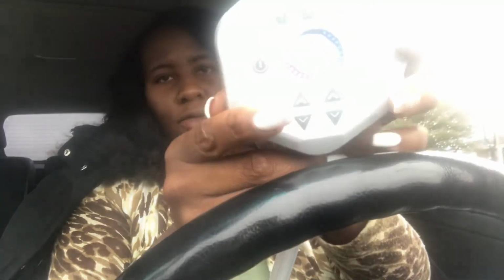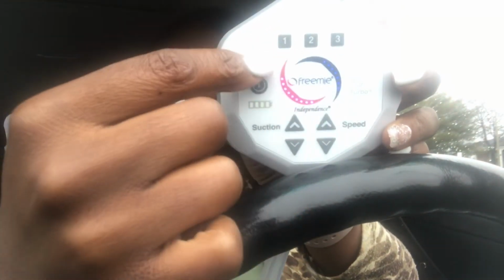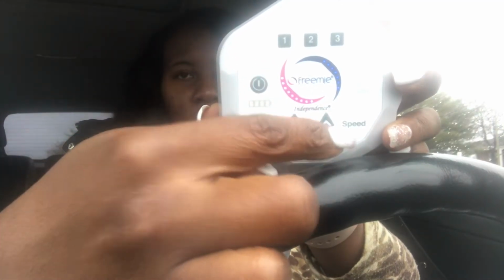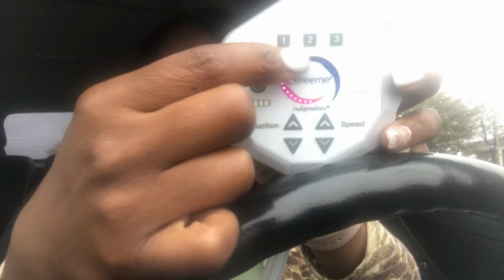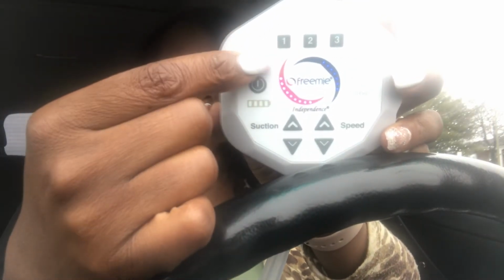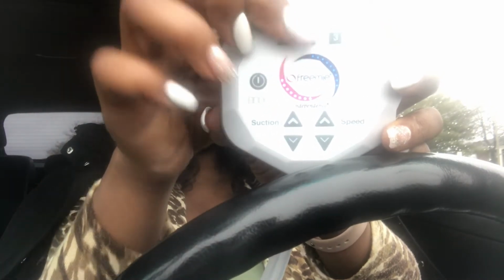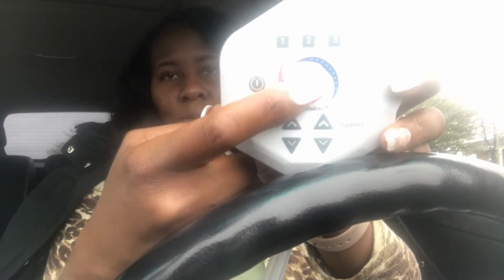The suction is pretty comfortable and pretty easy to adjust. Let's see if I can get some. There we go. So you have these numbers, 1, 2, and 3. You can set it to fit the suction or speed that works for you. I like to do a 1, 2, 3-ish system. So for my number 1 setting, I'll click it now. You can see the lights change. At number 1, my suction is lower, my speed is higher.